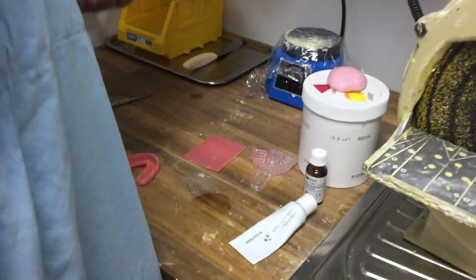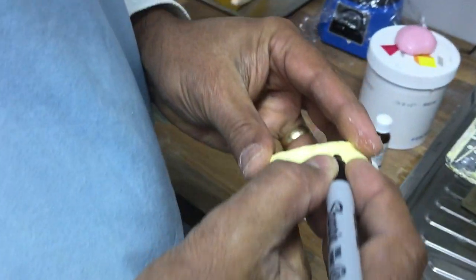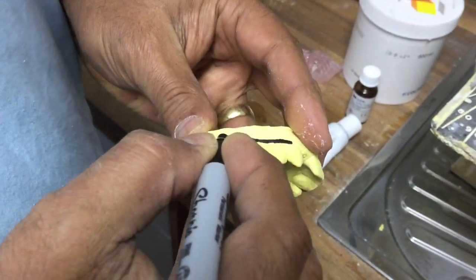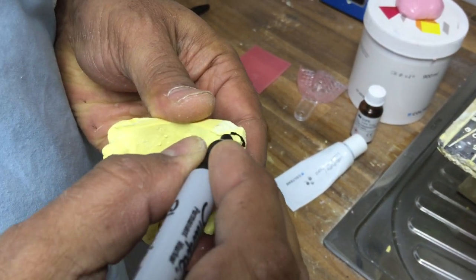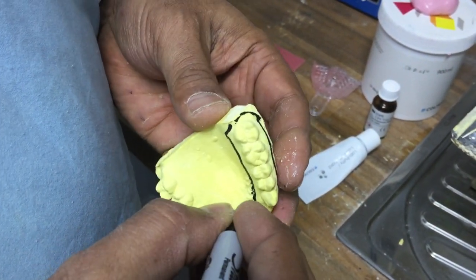I've pre-done some of this so the video won't take too long. I'll grab my marker pen. Normally when doing a custom tray, I want to take it down about three or so millimetres past the gingival margin.